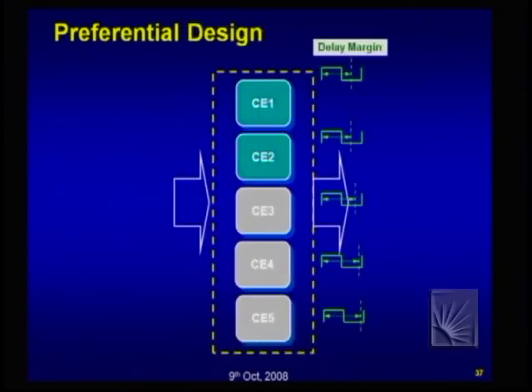Another interesting design technique which we are looking at in the context of implantable systems is that due to process variation, some blocks can fail, right? So, if you have a signal processing unit, some blocks, not all blocks, can fail due to process variation. Now, can you limit or contain the failures to non-important blocks or non-significant blocks? That is the idea. It turns out the typical signal processing application can be decomposed into significant components and non-significant components. If you can make sure by a preferential design approach that all failures that happen in the circuit only happen in non-significant components, then you can ensure graceful degradation in quality.